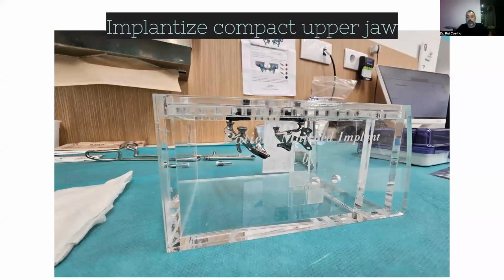So let me try to guide you through the surgery, okay, for you to see step by step how this type of surgery is done. So this is an implant that is sterilized like a regular implant. It's sterilized by ETO, so you cannot open it before surgery.